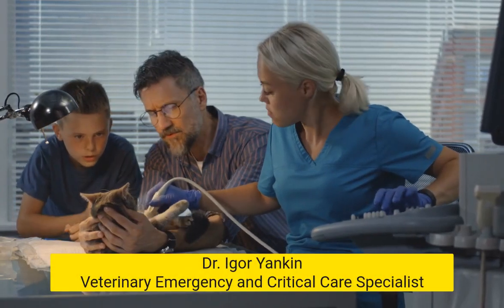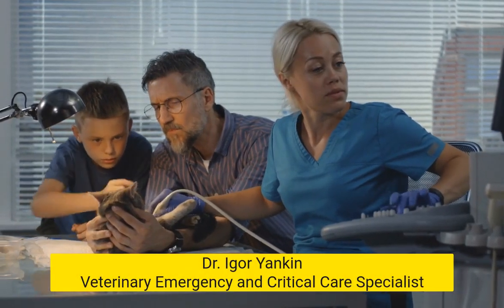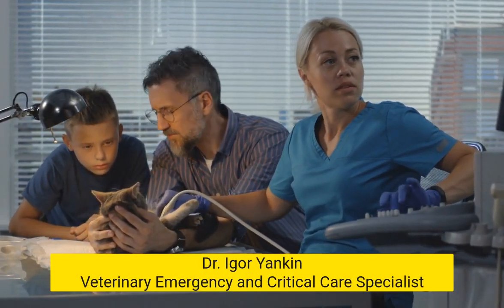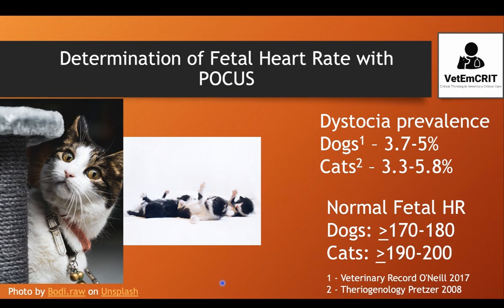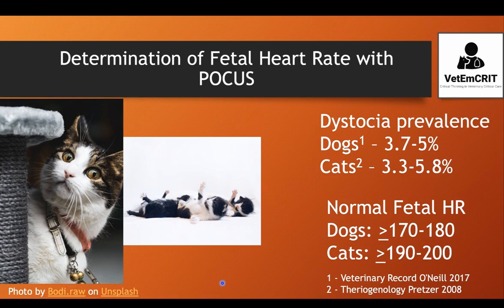In this video, we'll talk about how to obtain accurate fetal heart rate with point-of-care ultrasound. We know that dystocia is very common in small animal practice. Depending on the paper you read, up to 5% of dog and cat parturitions may be associated with dystocia.